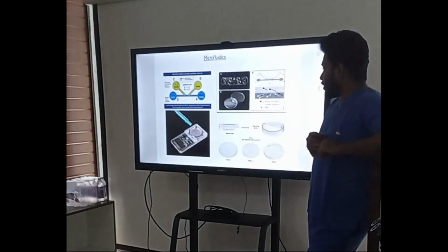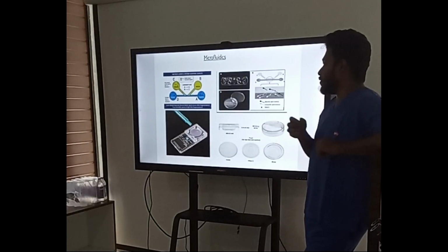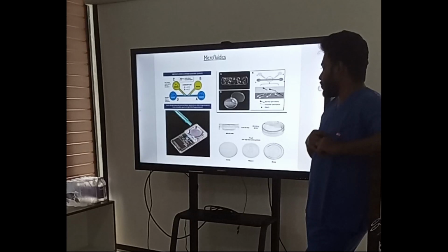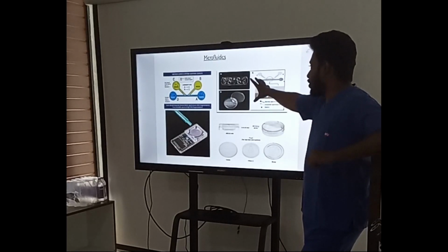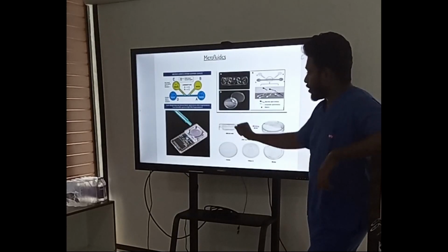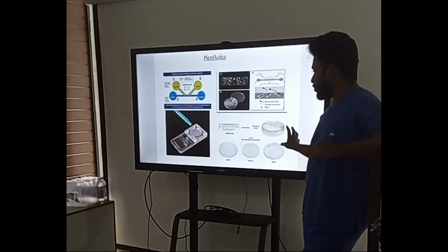Apart from density gradient, we have microfluidics for semen preparation, where centrifugation is not required, which is based completely on the fluid activity inside. We use this for ICSI purposes, but microfluidics you can use for either ICSI or IUI as well. This doesn't require you to do centrifugation.